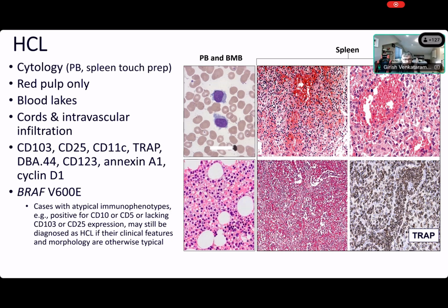The biggest bang for the buck is CD20 and cyclin D1. You could do a CD5 just to exclude a mantle cell lymphoma. In mantle cell lymphoma, you will have a bright cyclin D1 in the lymphoma, whereas in hairy cell, you will see kind of a weak cyclin D1. So just looking at the cyclin D1 pattern, I can tell you this is hairy cell.